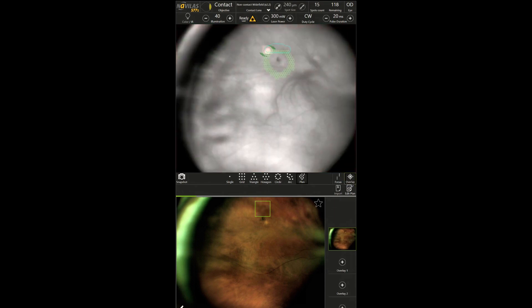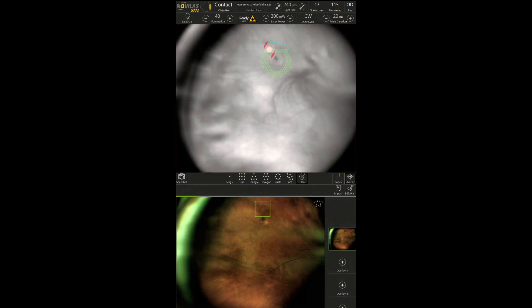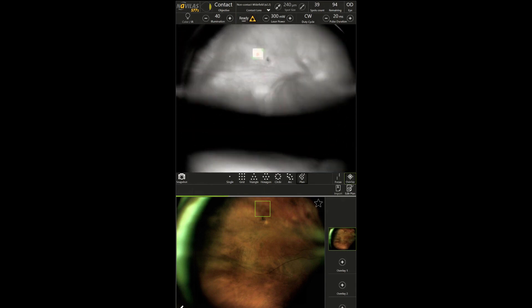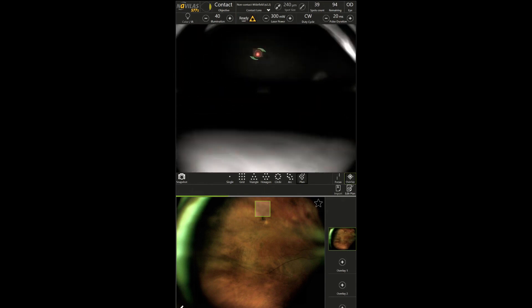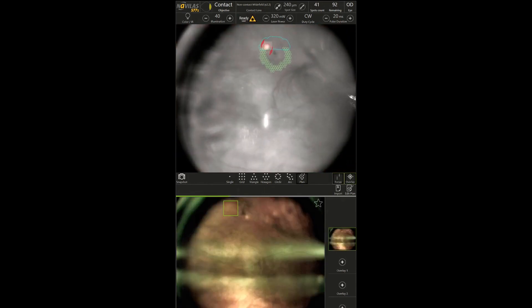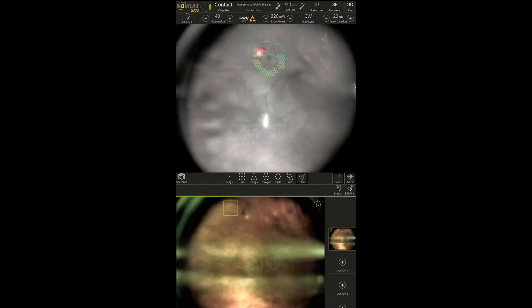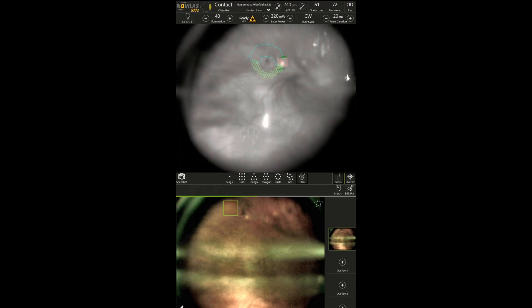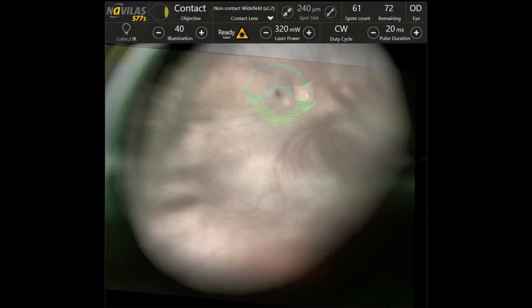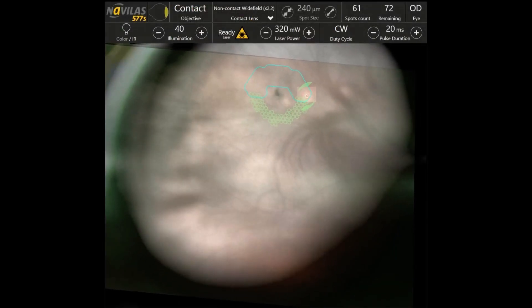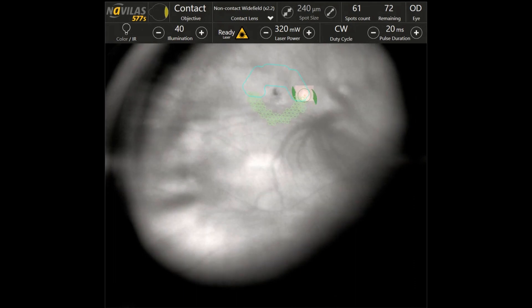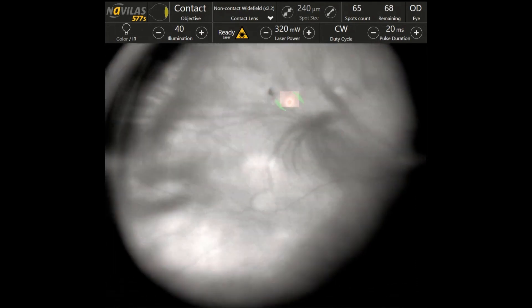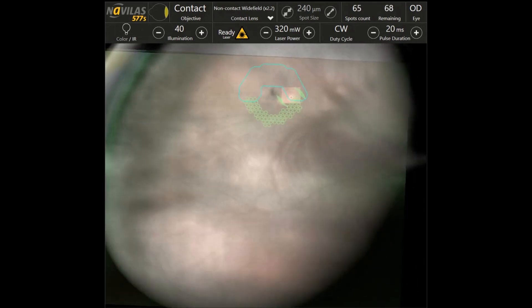Then the treatment proceeded on the selected parameters. Maximal mydriasis and eye moisturizing were crucial. Due to the possibility of pre-planned navigation treatment, the laser machine tracks eye movement and blinking, stopping the treatment automatically when needed.